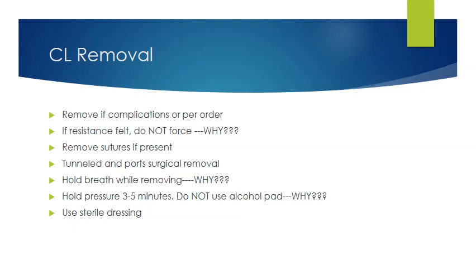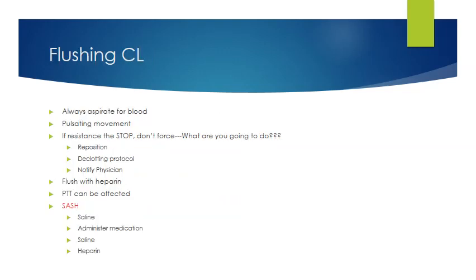When we remove them, we want to hold pressure for about 3 to 5 minutes, and we do not use alcohol pads. Why do we not use alcohol pads? I think that you probably learned this in pharmacology, and that's because the alcohol may interfere with the clotting, and so we may actually have more bleeding. And then we would cover that with a sterile dressing, and normally it's an occlusive sterile dressing, and that's normally on for about 24 hours, and then you can remove that.